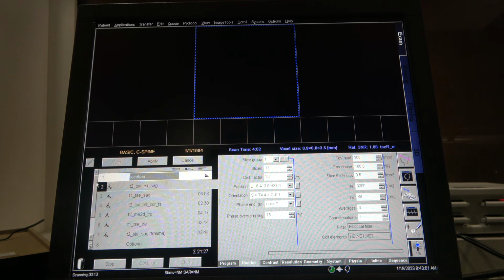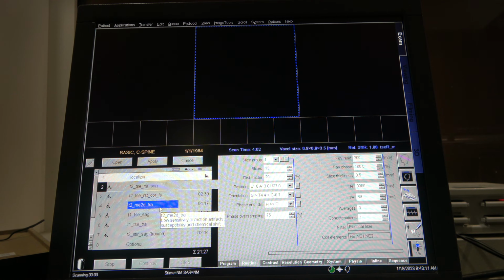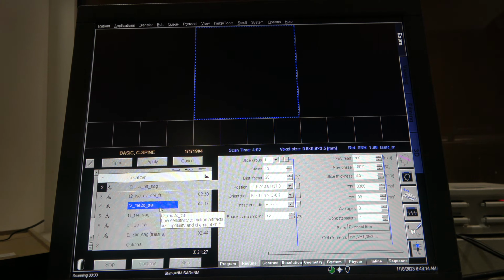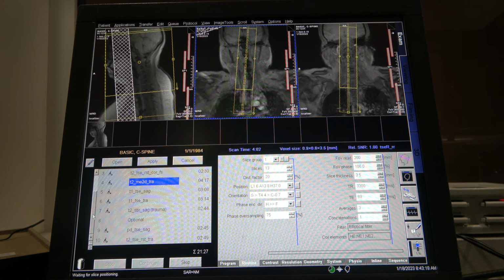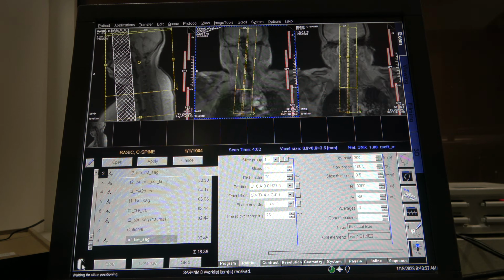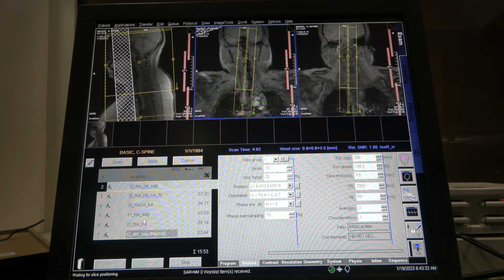All right. So once again, we're just gonna do whatever planes. One plane of each: a sagittal, coronal, and axial. But as you can see, this is our protocol here. When you don't want anything, remember, all you gotta do is click trash can. It's already highlighted. Trash can, already highlighted. Trash can. And we're not gonna do all these. We're just gonna do these three here, and then the rest is copy paste.